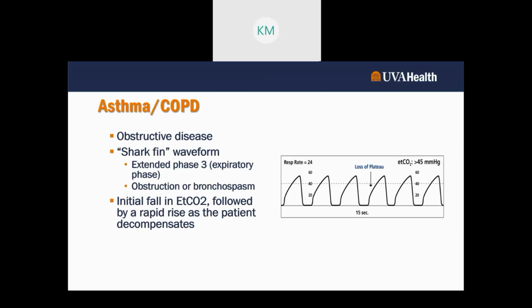I don't like really high end-tidal CO2s. I could be seeing my patient moving into respiratory failure. That's kind of what that signifies. So these are things that we want to keep in the back of our head.